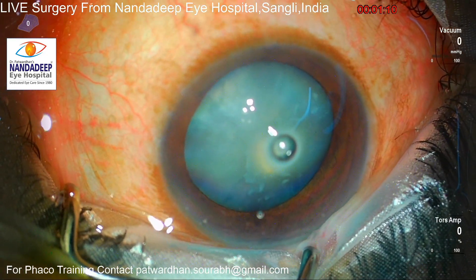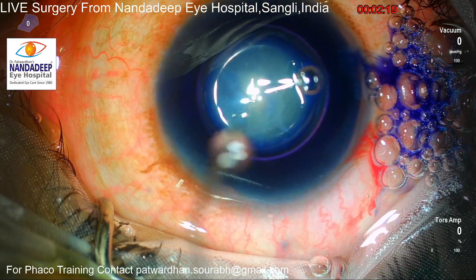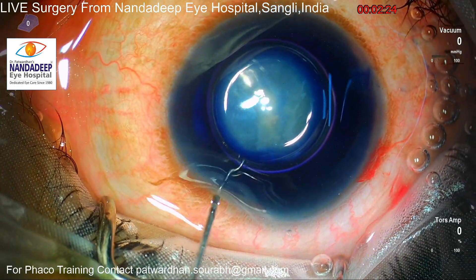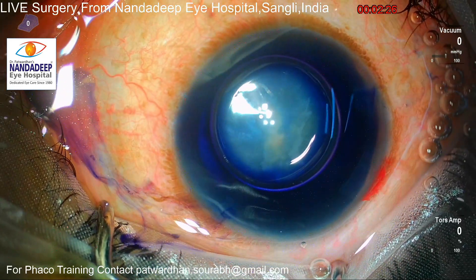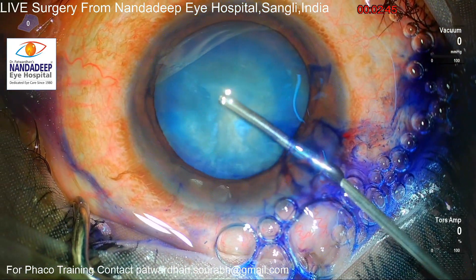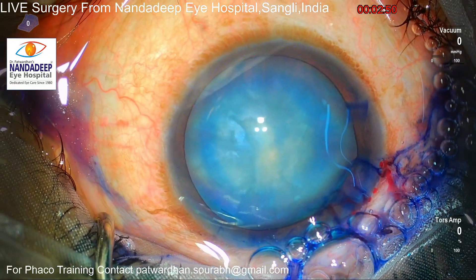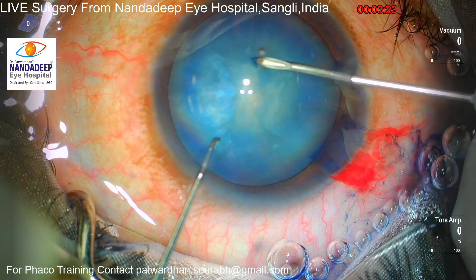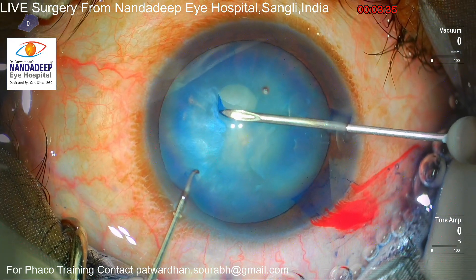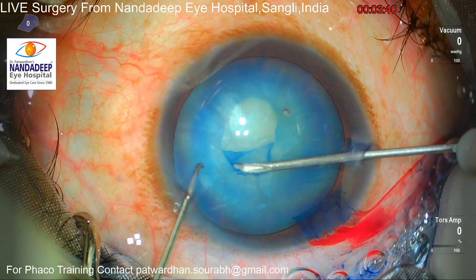As the patient cannot fix on the light, I am taking the center of the limbus while marking the CCC. As you can see, this is a white cataract and there are some anterior subcapsular fibrotic bands. The other eye of this patient has plus one error for distance, and he already needs to use presbyopia glasses, so I decided to go ahead with an extended depth of focus IOL in this case.